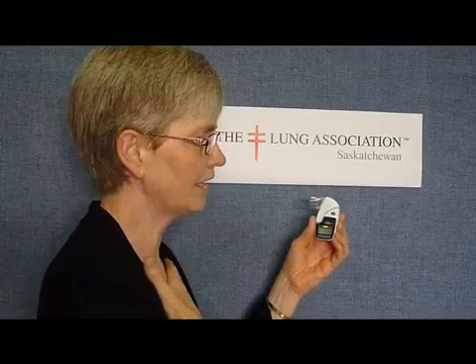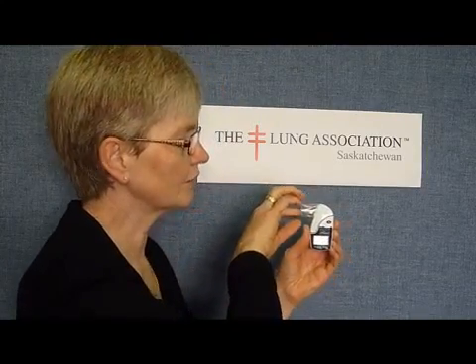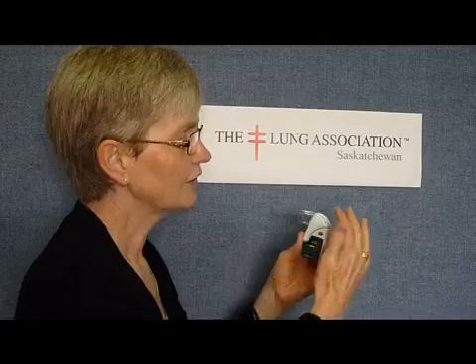It's a pretty simple machine, but there are a few tricks to it. You want to be standing when you're doing the test. You want to be sure you seal your lips nice and tight around the mouthpiece. You want to take in as big a breath as you possibly can. And when you blast it out, you want to blast it out through the machine for about two or three seconds. You also want to be sure that you haven't blocked the top of the machine, so you want to hold it something like this.